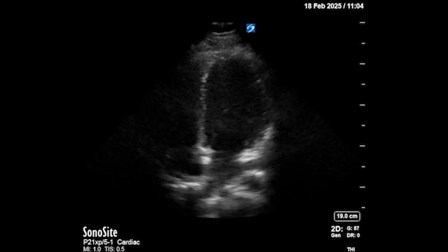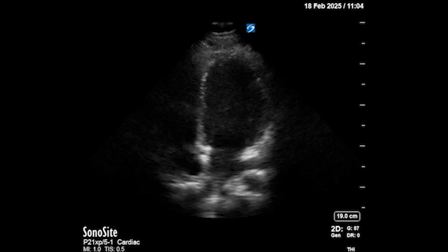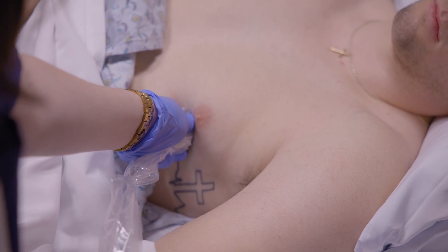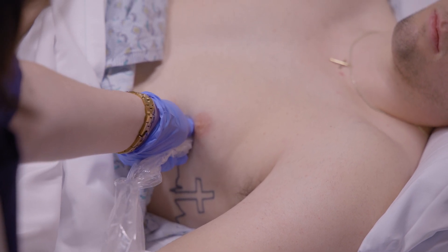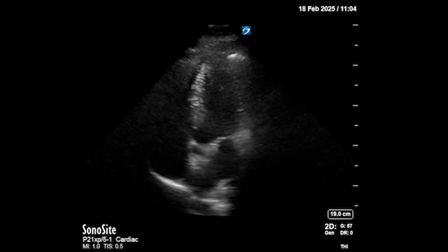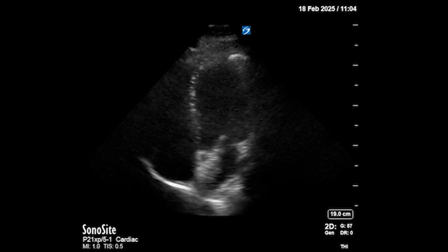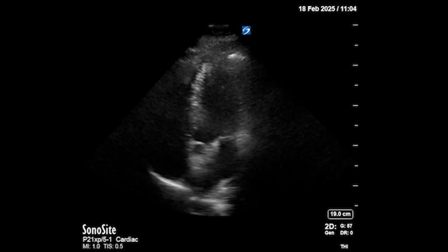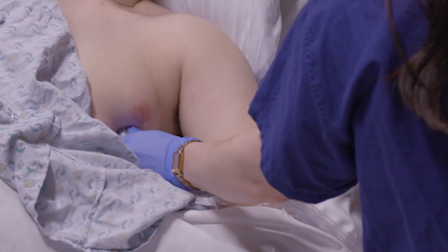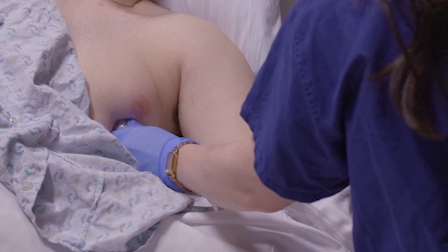Lauren has a pretty textbook four-chamber view. To bring in the fifth chamber, she makes a very slight clockwise rotation of the probe to get a nice opening of the aortic valve. The fifth chamber refers to the LV outflow tract — by convention that's what it's called, though it's not an actual chamber. She dropped the tail of the probe down, tipping it more anteriorly, bringing in the aortic valve and the LV outflow tract.